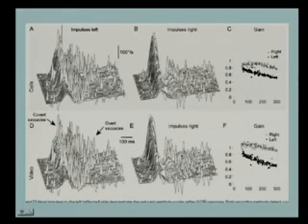Here are the head impulses to the right, and here are the head impulses to the right with video and coils. You'll see they're identical. These are recordings made at the same time. So you can see every single eye movement that is there in the coils is there in the video. This is to the affected side, and you can see head impulse with the coils, lots of covert saccades occurring during head movement, some overt saccades afterwards, and every one of those saccades is present in the video recording.